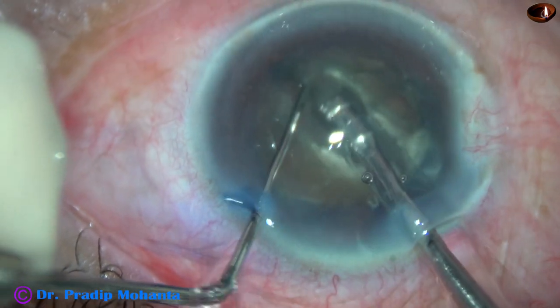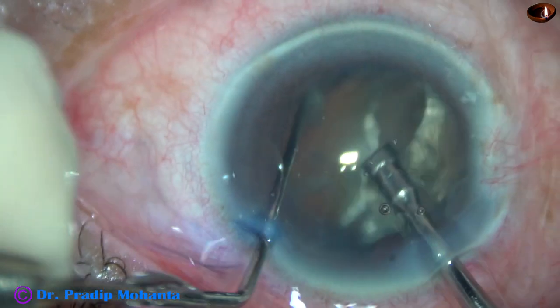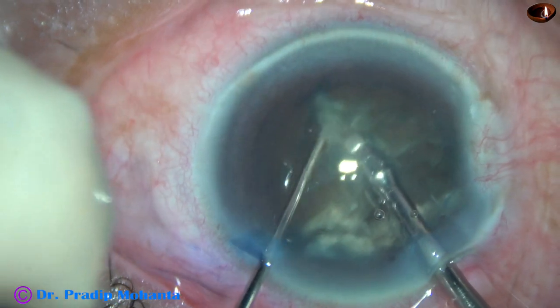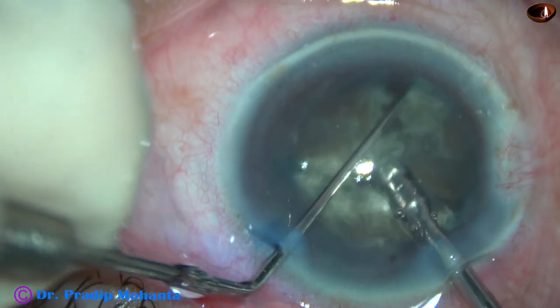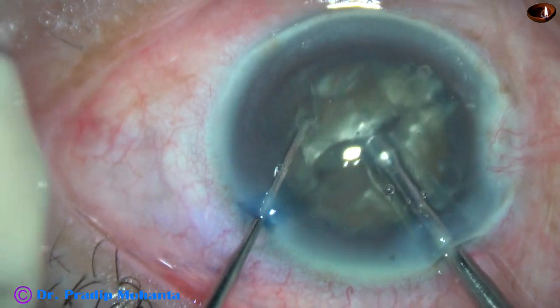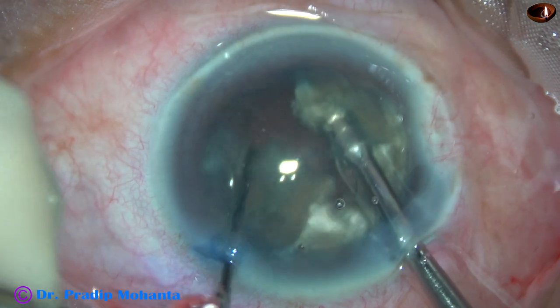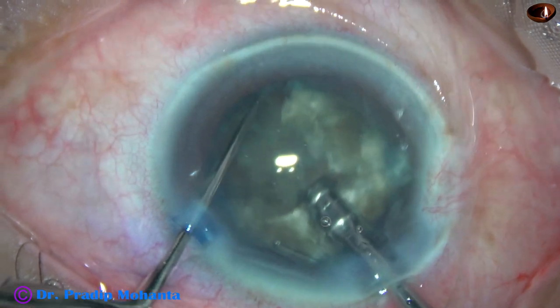Now I rotate 180 degrees and separate the two hemi-nuclei completely. Each hemi-nucleus is again chopped in the same way. The tip goes through the substance of the nucleus and it is chopped. This is the other hemi-nucleus. Now we have completely separated four large fragments.